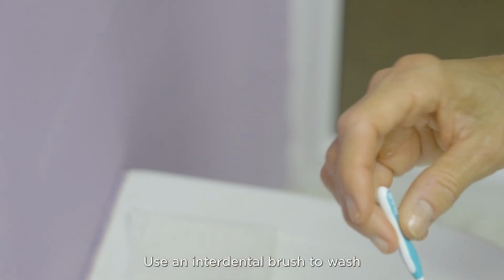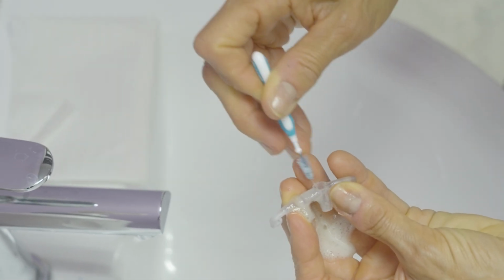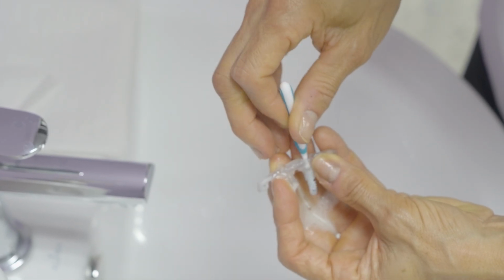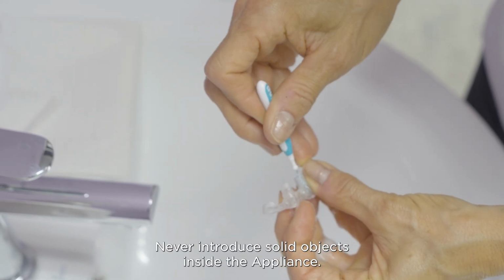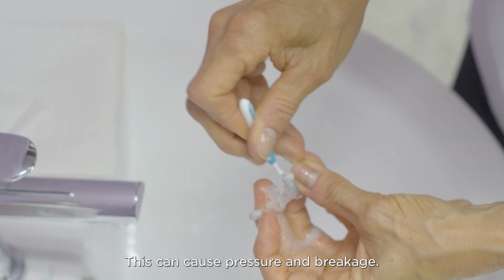Use an interdental brush to wash the inside of the appliance and remove secretions. Never introduce solid objects inside the appliance. This can cause pressure and breakage.